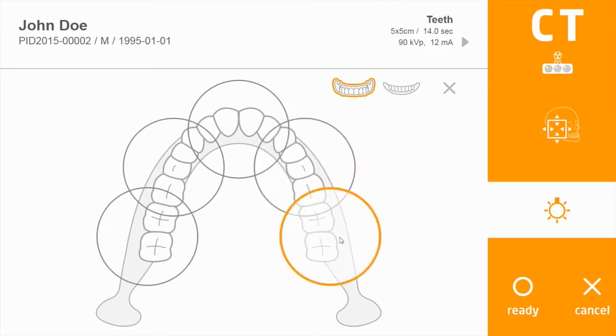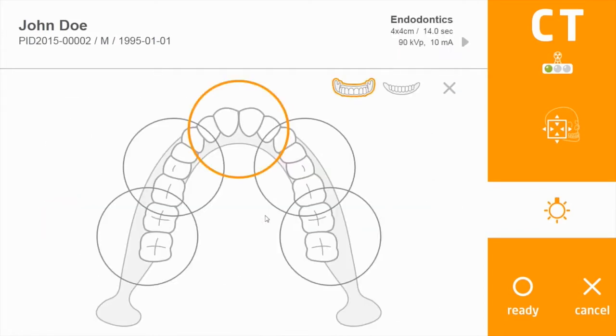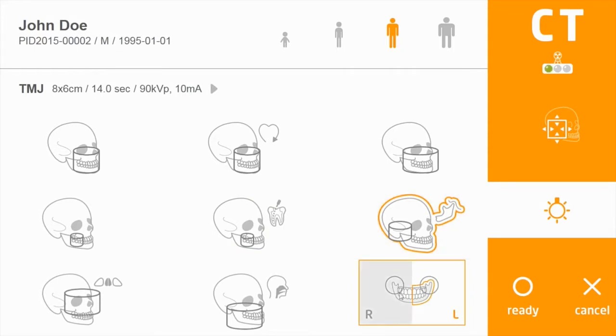By clicking the icon, you will have a slightly different interface. It lets you select the areas you are interested in. Also, you can choose either mandible or maxillary scan with a single click. The next option gives the highest resolution at 70 micrometers with the same concept as previous. Right of that is scanning a single unilateral TMJ 3D acquisition.